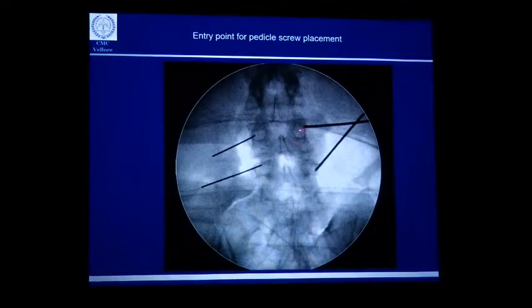When you're passing the pedicle probe, the first 2 centimeters or 20 millimeters of the pedicle probe will go through the pedicle and then it reaches into the vertebral body. During that time, you are directing the pedicle probe lateral to medial, so that when you pass 20 mm of pedicle probe, the tip of the pedicle probe should reach the medial part of the pedicle. Is that clear?